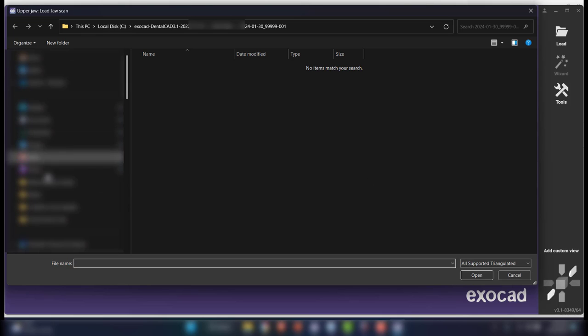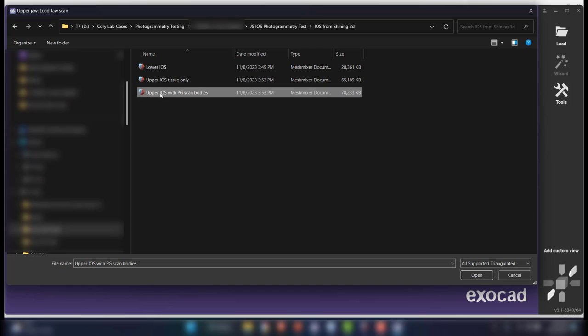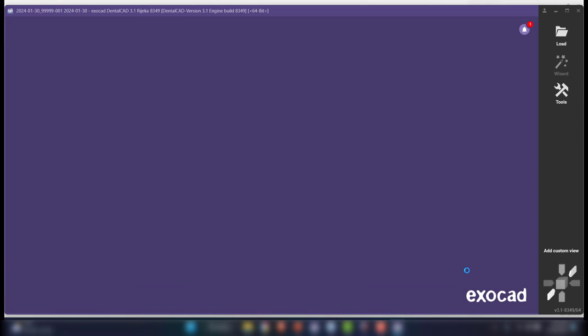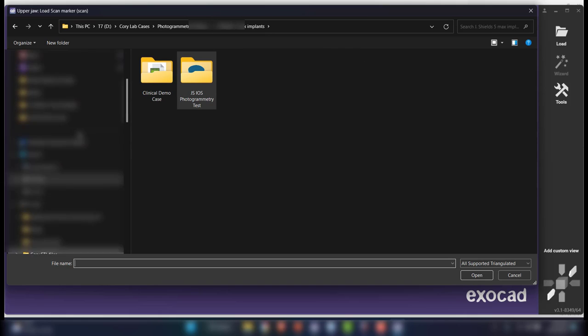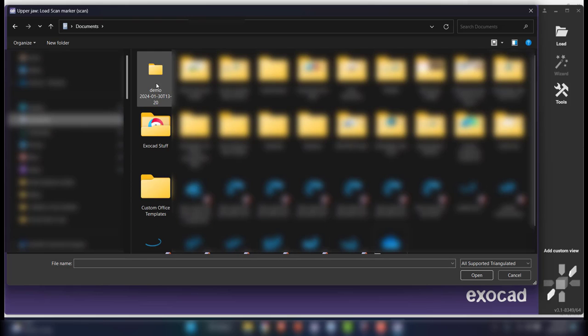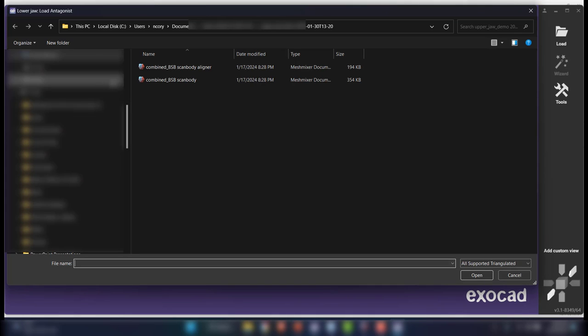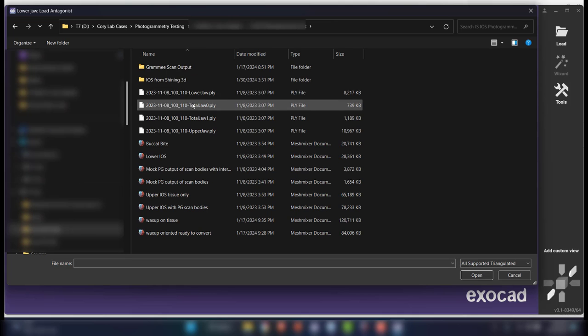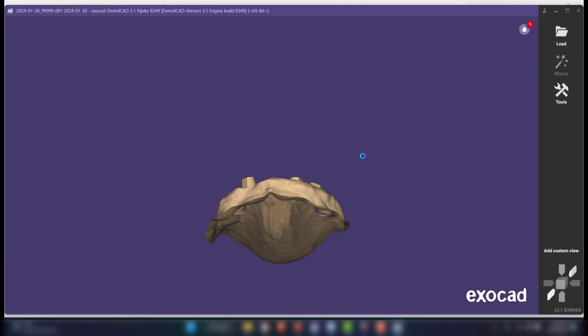Okay, so load the upper jaw scan. Let's go and find that. All right, this is the upper intraoral scan with the photogrammetry scan bodies. Now it's asking for the upper jaw with scan markers. This is where things change a little bit, because we need to pull in the Grammee data. In my documents where I have that folder saved, we want to pull in the combined BSB scan body aligner. That's the one I suggested exporting. We'll pull that in. And then finally we need to bring in the lower intraoral scan. Back in the other folder I was just in, there's the lower intraoral scan. That's our antagonist. So we'll click OK.